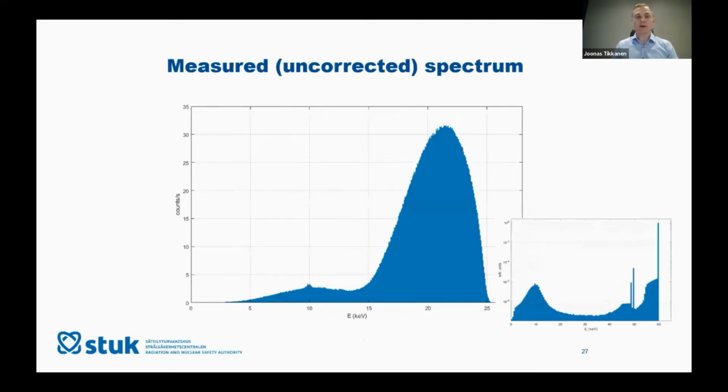If you remember how the measured spectra look, we are getting counts on all of the channels of the spectrum, even if we have a monoenergetic source. But now with X-rays, we have a continuous source, and we get the same continuum from all of the energies, which are mixed with the actual counts that we want to measure. So we now need to come up with some method to get rid of these so-called extra pulses from the spectrum.